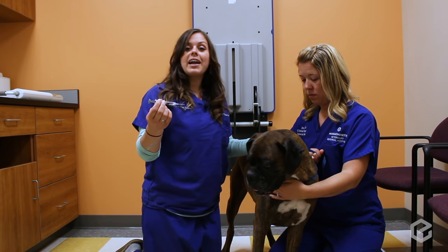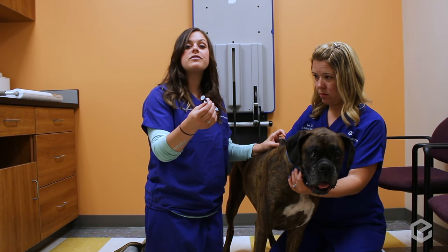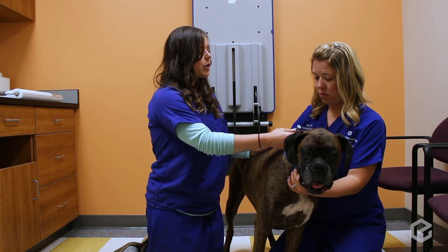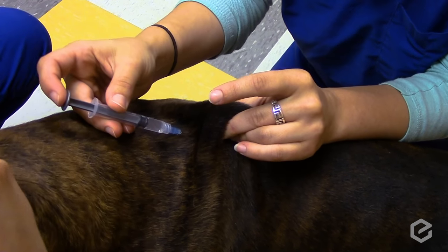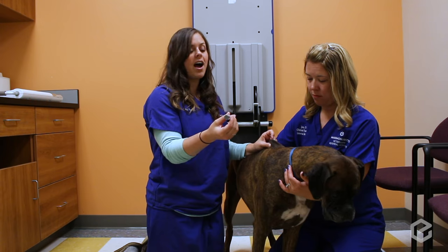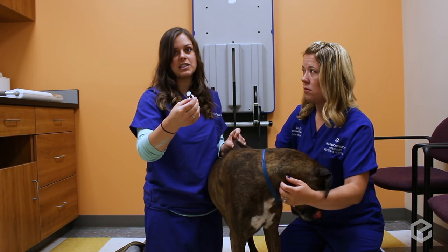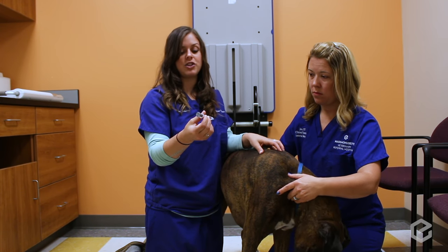When you're all set, find that little pocket, use a 45-degree angle, and go ahead and give them a little poke — a nice little jab. It doesn't have to be hard and long, but you don't want to go too slow because that could hurt and you may not find the subcutaneous space that we're looking to inject the medication into.